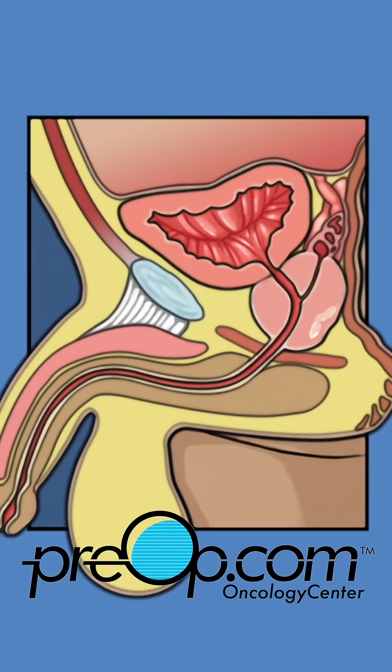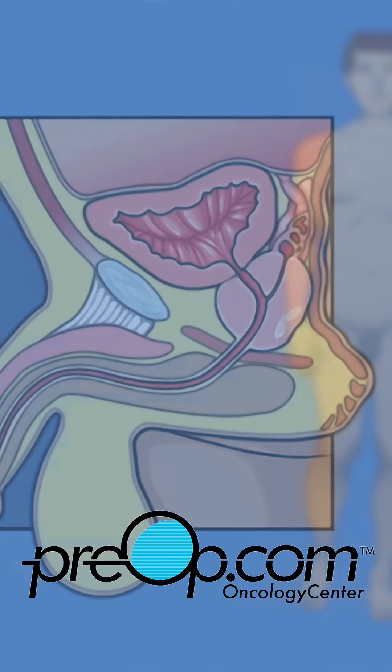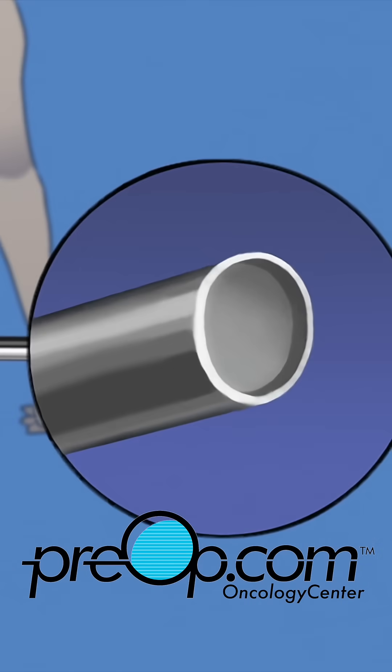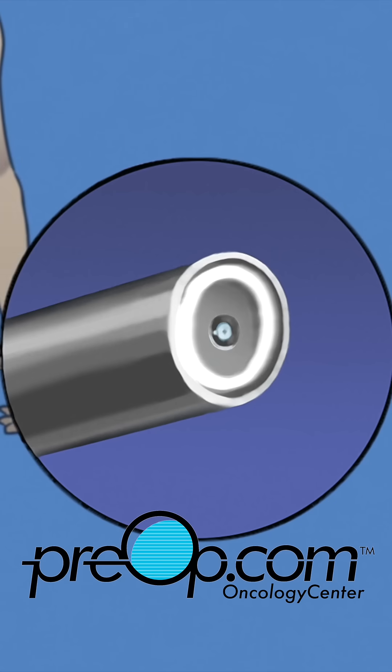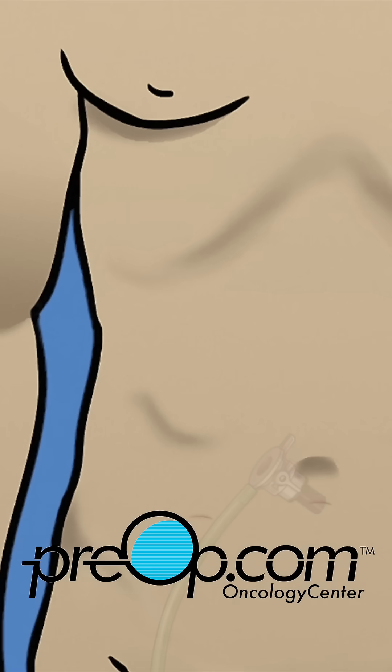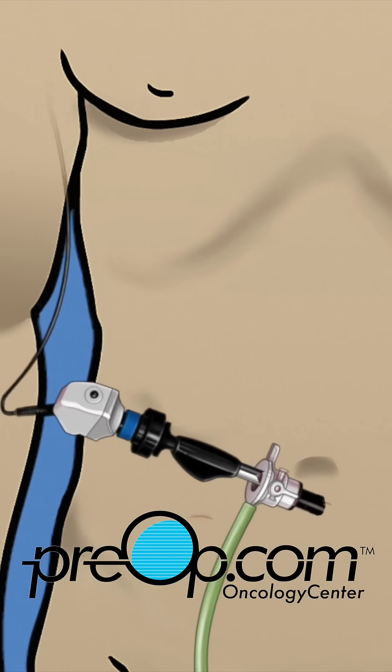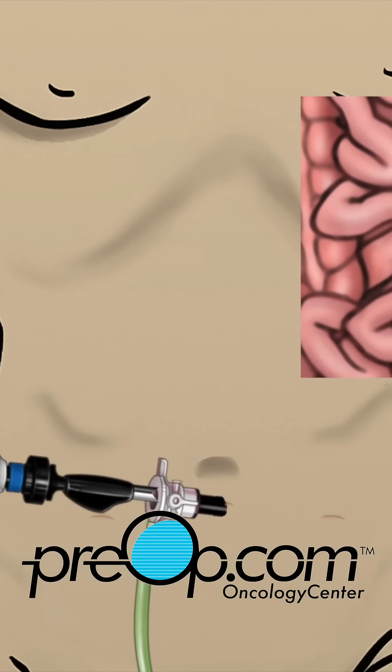There are different ways to operate and remove a cancerous prostate. Your surgeon has recommended a laparoscopic procedure. A long instrument with a light and camera, called a laparoscope, is used. The scope makes it possible for your surgeon to see and operate on hard to reach delicate tissue.